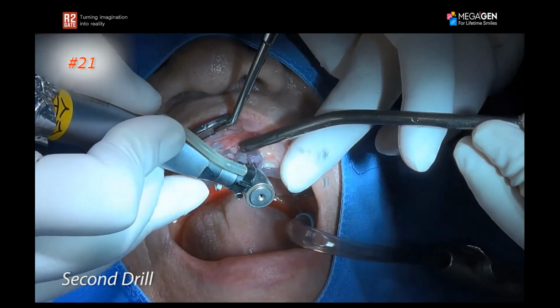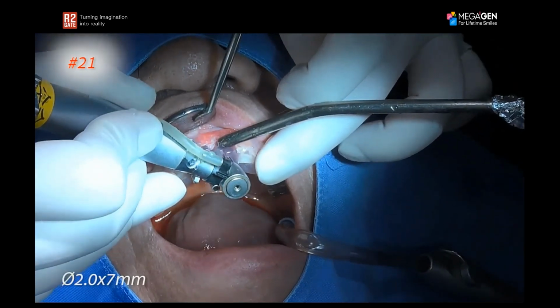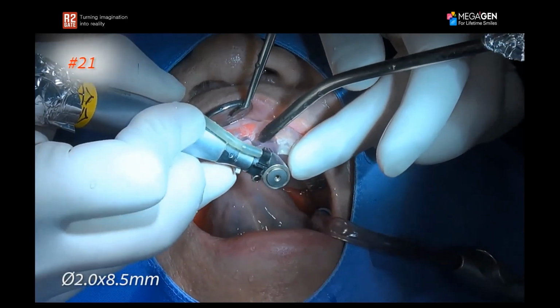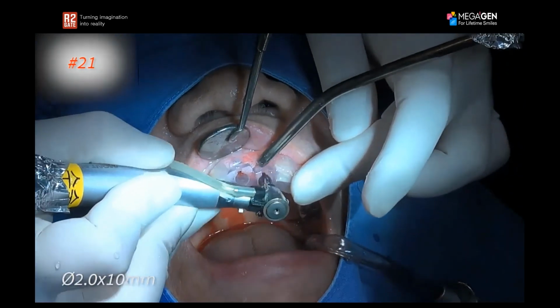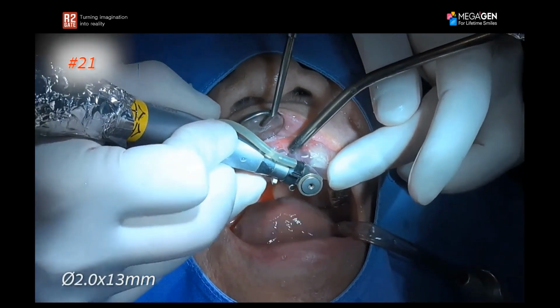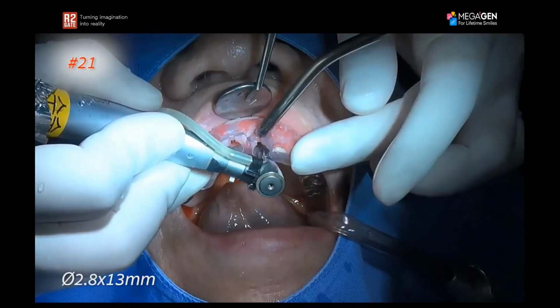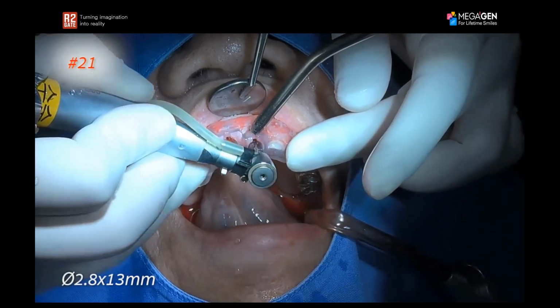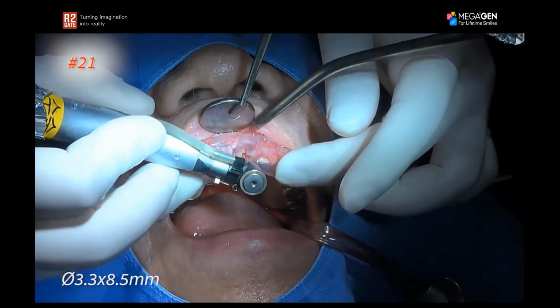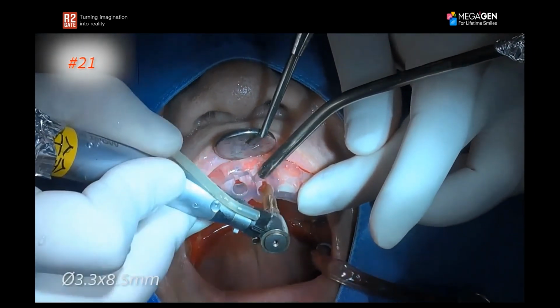After the initial drill, we'll use the second drill, and then I'll start to use my standard drills. I'll start with the shortest and the narrowest drill, which is 2.0 by 7, and then I'll increase the length to 8.5, then 10 millimeters, and then I'll increase the final length to 13 millimeters, which is the final length. After reaching the final length, I'll start to increase the diameter. So I'll start with 2.5, 2.8 millimeters by 13, and then I'll use my 3.3 by 8.5 to do what we call a segmental or step back osteotomy.